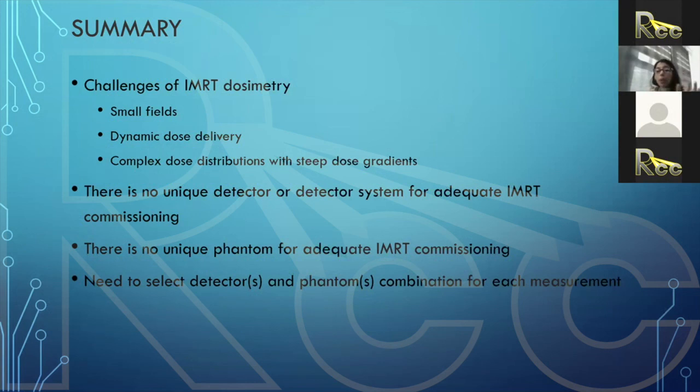So you have to go back to the treatment planning system and move the location of your ion chamber to a place where it's more homogeneous in order to get your absolute dose measurement to pass. And when I say pass, at least when we were using films, we were looking at a discrepancy below 5% between what is measured and what is calculated by my treatment planning system.